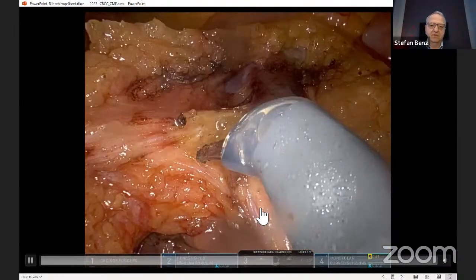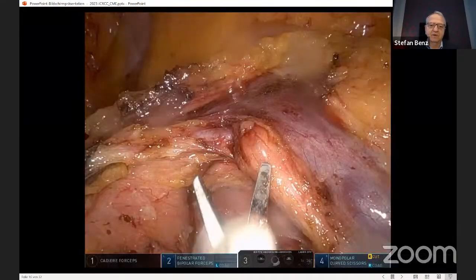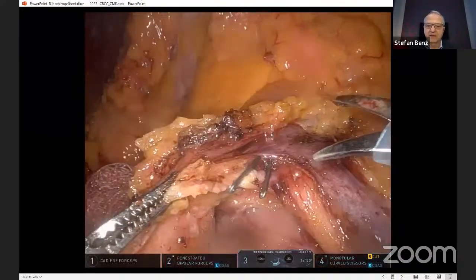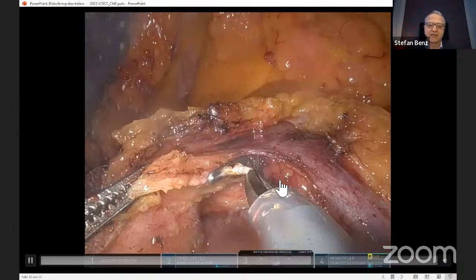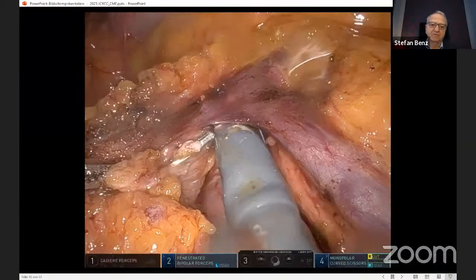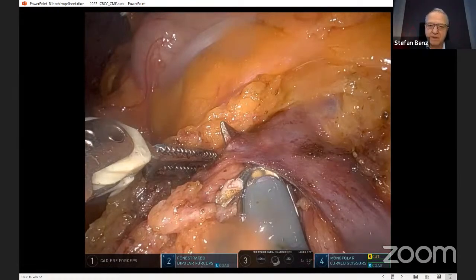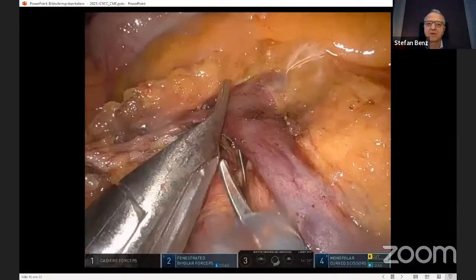And you see how you fairly easily get along the artery. And the advantage is you have a perfect view on the pancreatic head already at this stage. So you always know where you are, and you can perform a lymphadenectomy on the dorsal side of the vein, here the iliocolic vein. And then you have reached the base of the mesocolon. That's where the dissection stops at this point.